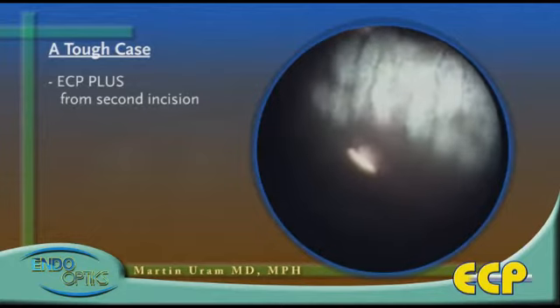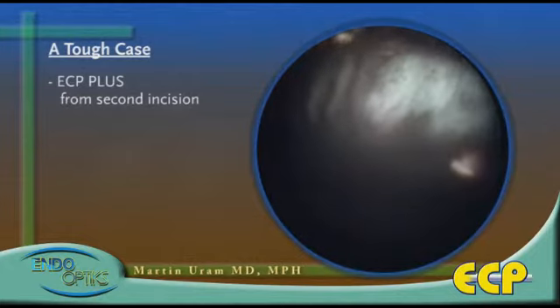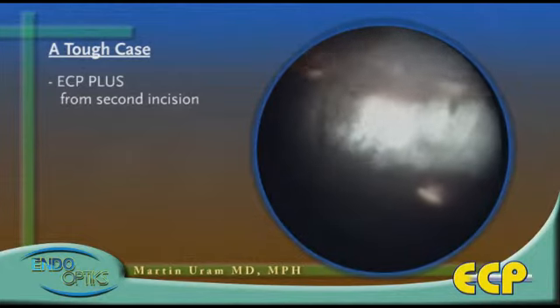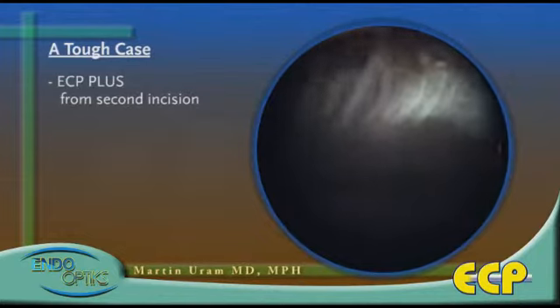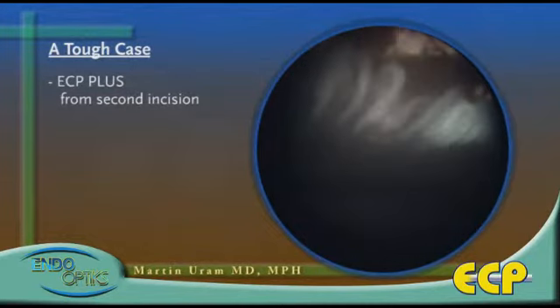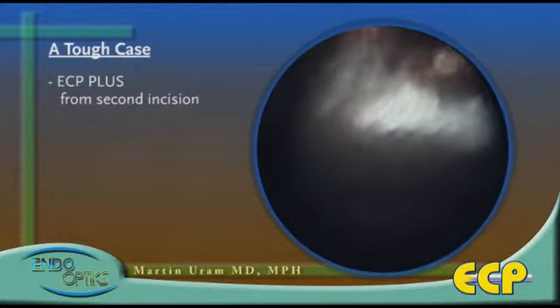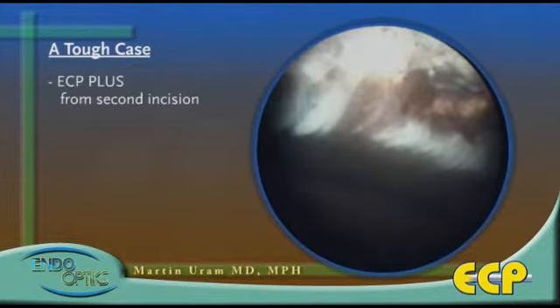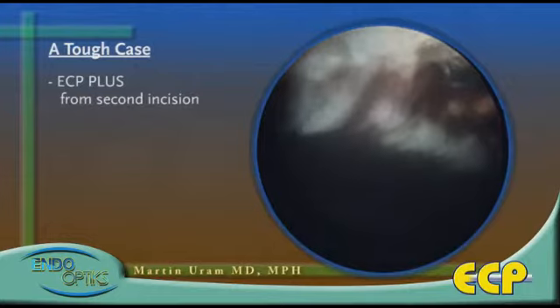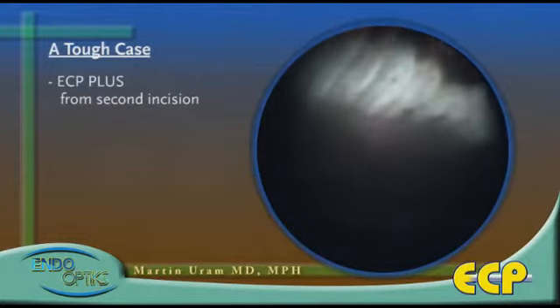Often, this treatment will result in breakdown of the blood aqueous barrier with more flare postoperatively. In these eyes, we usually inject 0.1 to 0.3 cc's of Decadron coming from a 4 milligram per cc bottle in order to limit any postoperative inflammation that might be observed. This is the last patch of processes that completes the 360-degree ring.